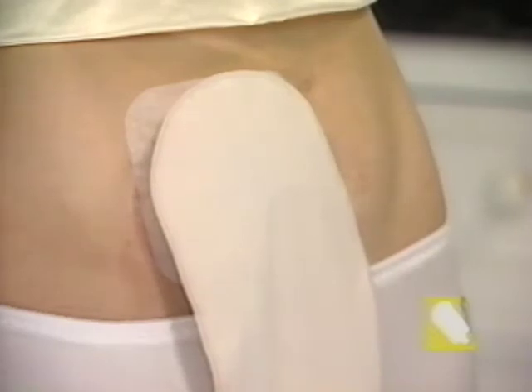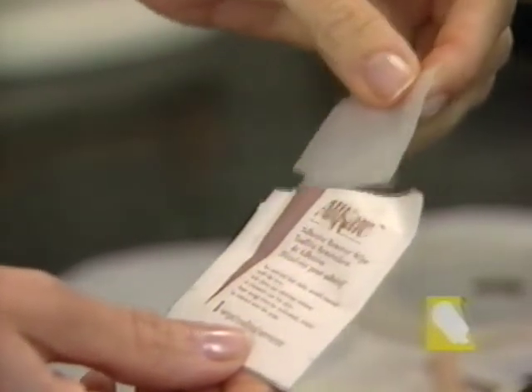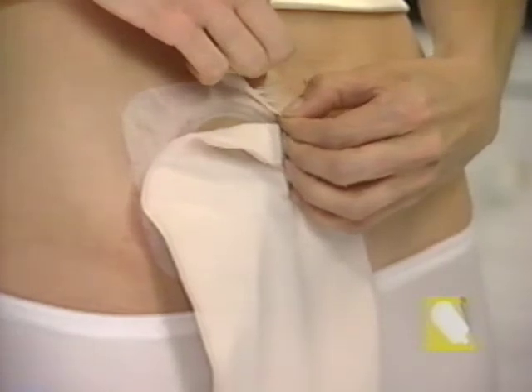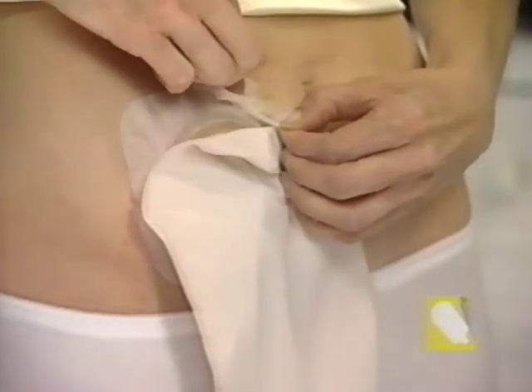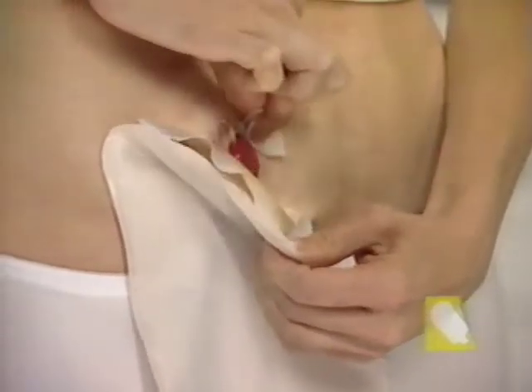Now, remove the system you're wearing. To remove the old adhesive, clean the surrounding skin with an all-care adhesive remover towelette. Lift a corner of the skin barrier or tape. Wipe the adhesive remover towelette between the skin and the adhesive. Gently peel the adhesive back while continuing to wipe. Then wash the skin thoroughly with a mild oil-free soap and pat dry. Remember that any oily substance will cause poor adhesion of the wafer.